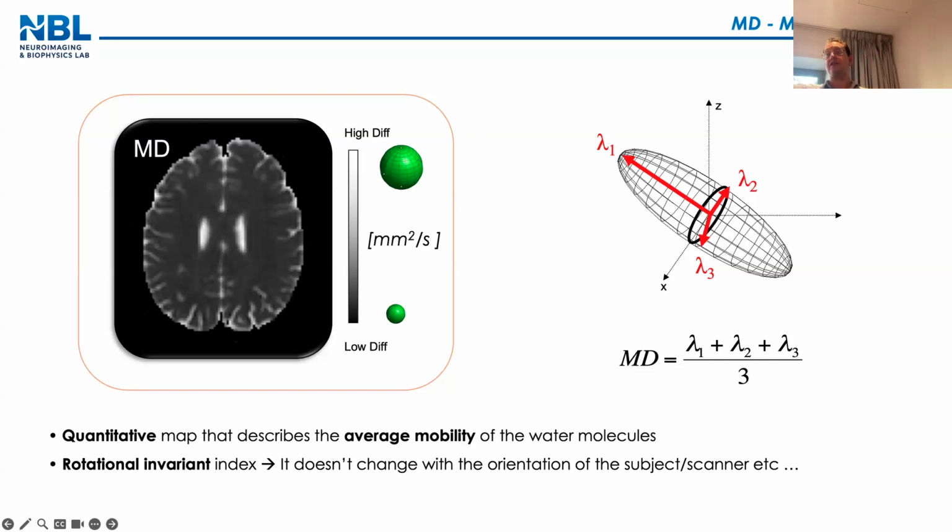Because if I'm going to explain to you the physics of diffusion, that would be half an hour on its own. So what I'm saying is the B value is the contrast, the way in the sequence that I can make the image sensitive to the mobility of water molecules. How sensitive is set by the B value: the higher the B value, the more the contrast. Let's leave it here for now, because if we're going to talk about neuroscience, emergent property, you don't want to go into MR physics, because that's where we die. Okay? Right. So let's go back to what we were saying.